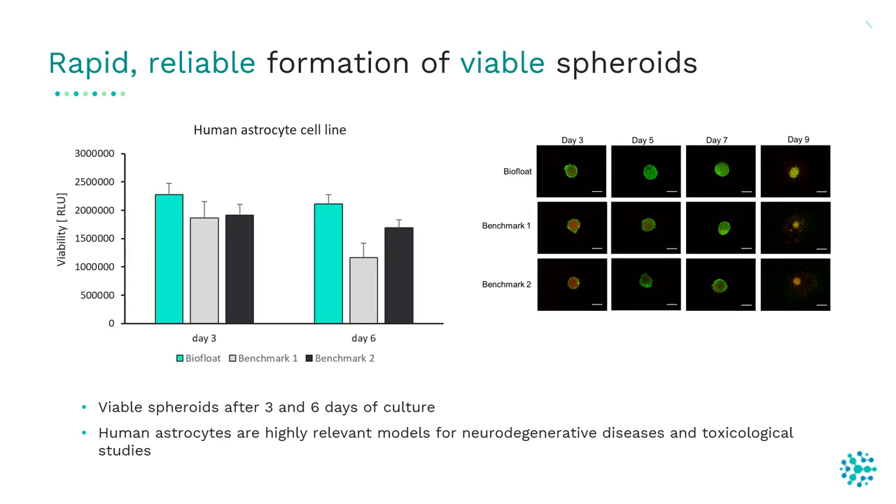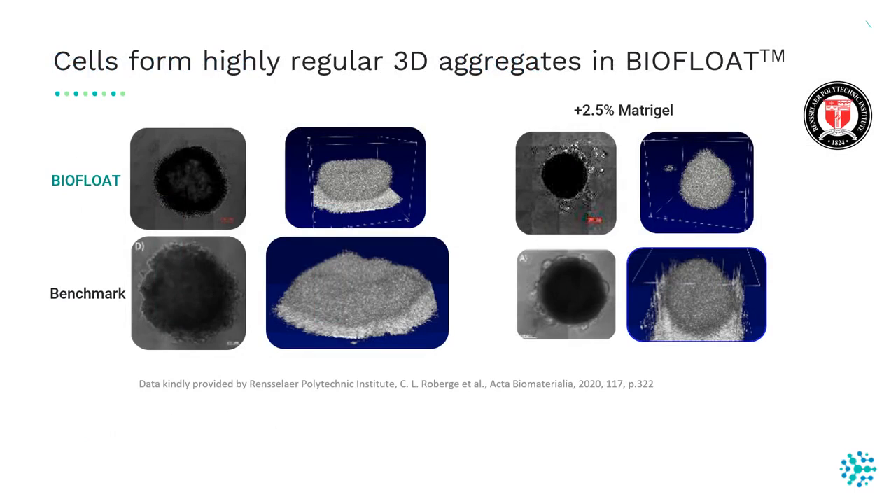It can happen that cells in an ultra-low attachment plate aggregate but do not form a real 3D structure — for example, in this benchmark product. On the contrary, in the BioFloat plate, spheroids are more three-dimensional and show a highly regular shape.